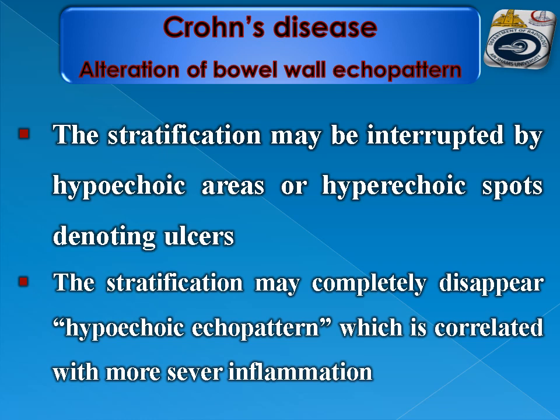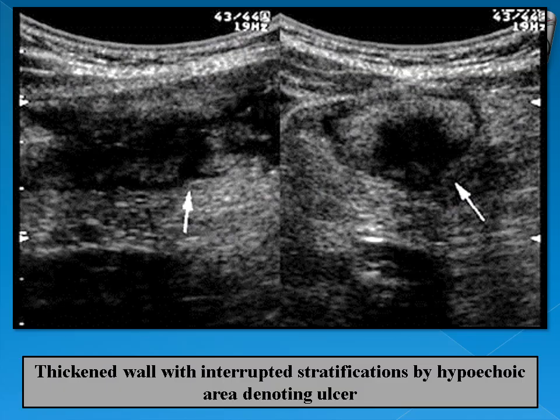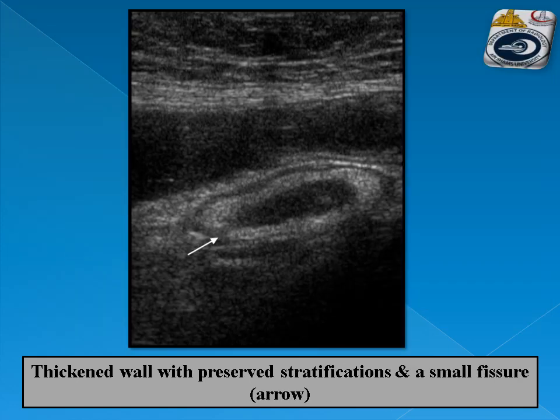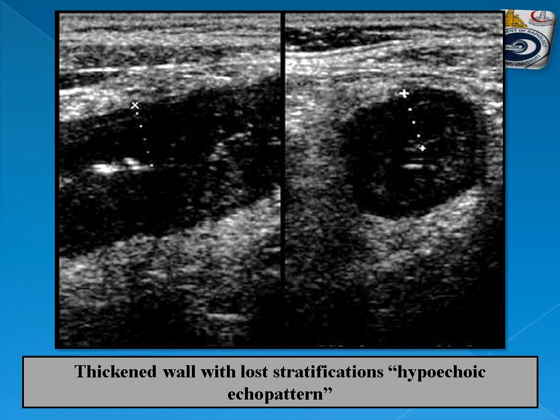The stratification may be interrupted by hypoechoic areas or spots denoting ulcers, or the stratification may completely disappear — called hypoechoic echopattern — which is correlated with more severe inflammation. Examples show interrupted stratification by hypoechoic fissures or ulcers, and a small hypoechoic fissure crossing the wall and interrupting its stratification. Complete loss of stratification is called the hypoechoic pattern of the bowel wall.